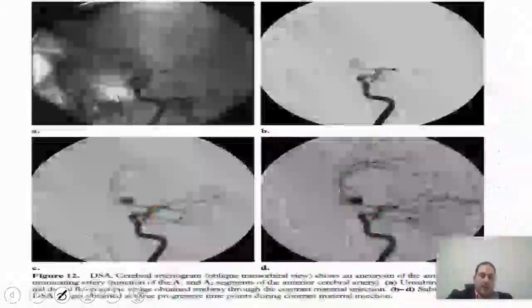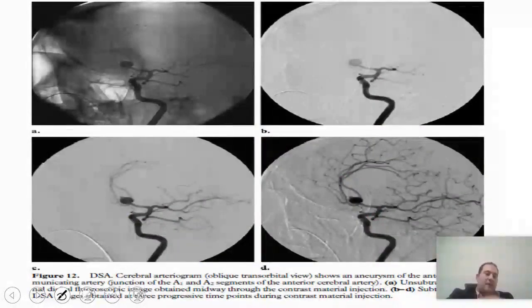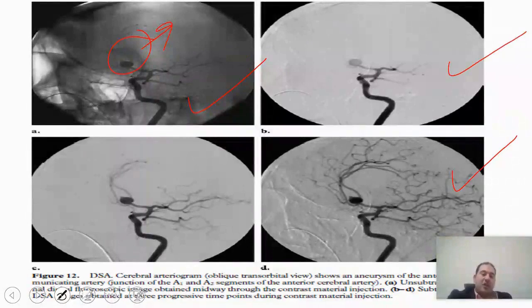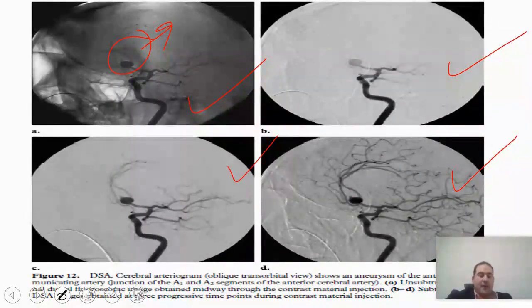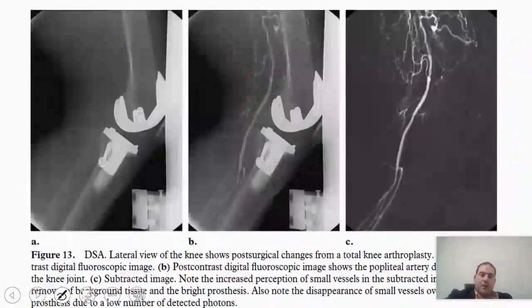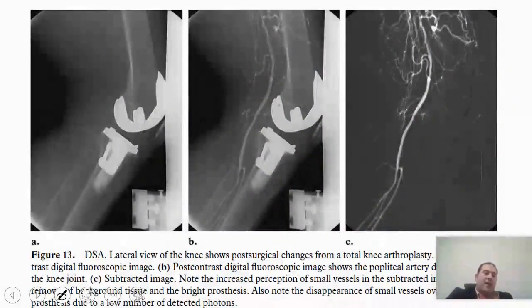Here is an example of a case of cerebral angiography with a significant aneurysm. So, it started performing the subtraction with different frames, and you have different frames as you can see. It removed the part of the skull from your images, and this is also the pre-contrast image.